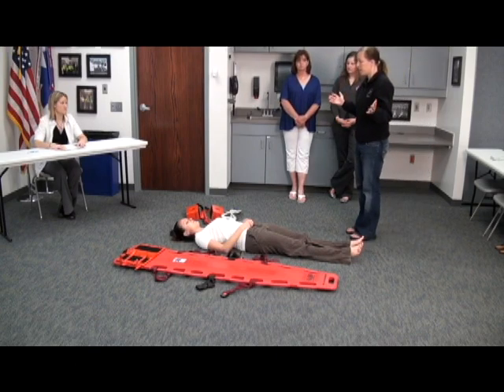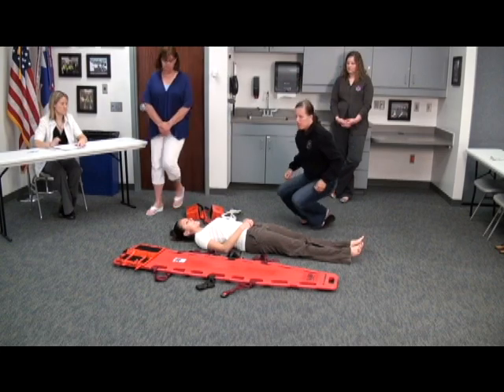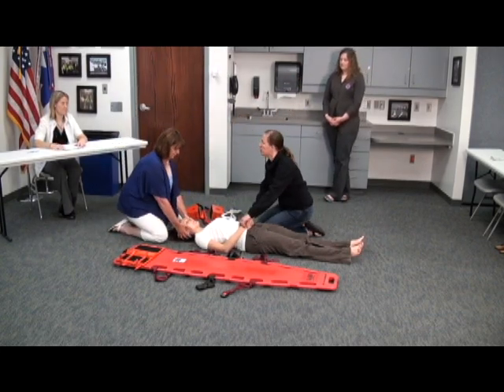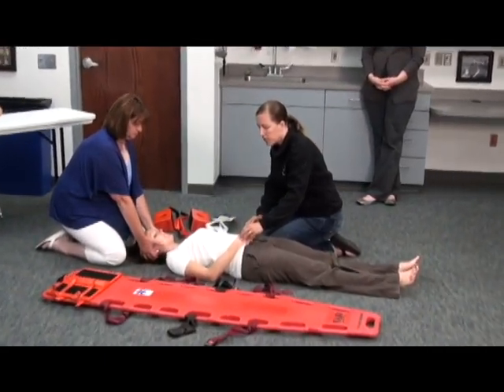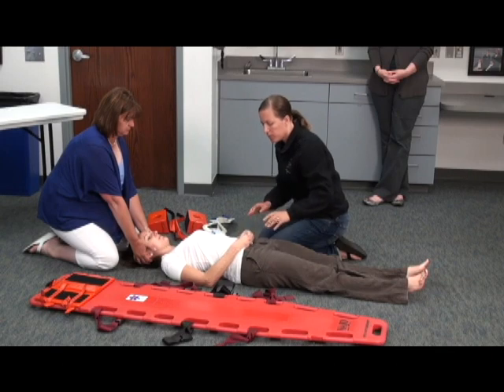I'm going to walk in and BSI, and I'm going to have you hold C-spine, please. I'm going to come down and check CMS. I'm going to check the pulses. Does she have good pulses? Pulses are good. Ma'am, can you feel me touching your hands? Yes. Which hand am I touching? Right. And now? Left. Can you squeeze? Can you move your fingers?